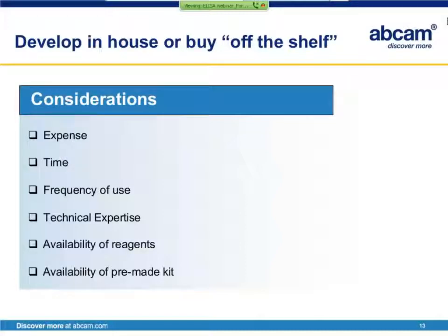However, if you imagine using this assay for an extended amount of time and think this assay will become a staple for your lab, then it's probably worthwhile to develop your own assay, because in the long run, you will pay much less than if you were to purchase the equivalent amount of kits from a supplier. Time is another important factor.